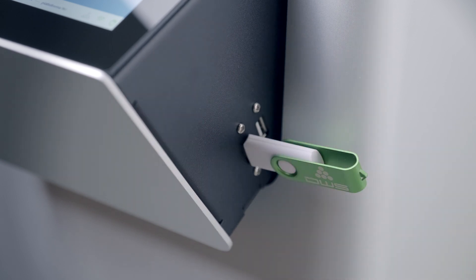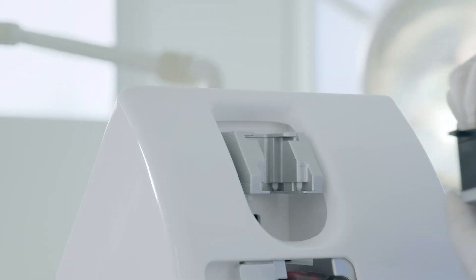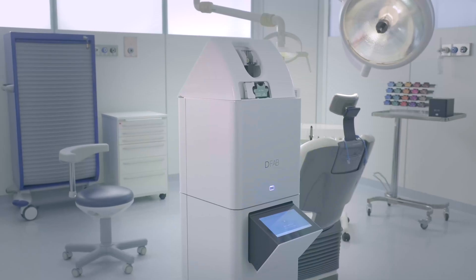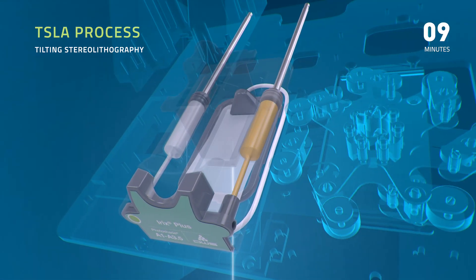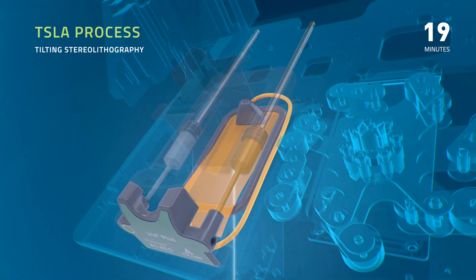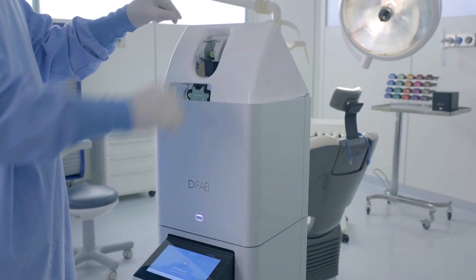Using Nauta Photoshade proprietary software, the operator can quickly and easily set the position and amplitude of the desired color shade on the 3D restoration model. All that remains is to insert the printing platform and the disposable cartridge.